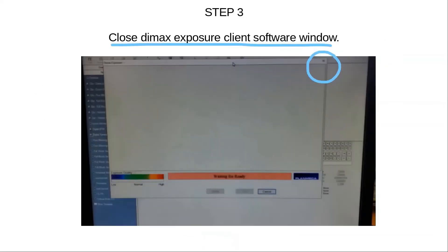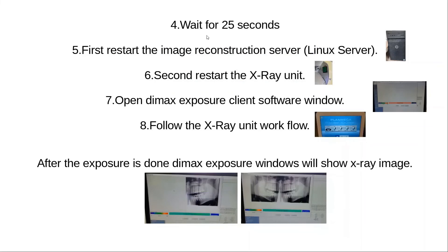In step 3, close the Dimax exposure client software window on your Windows machine. In step 4, wait for 25 seconds.